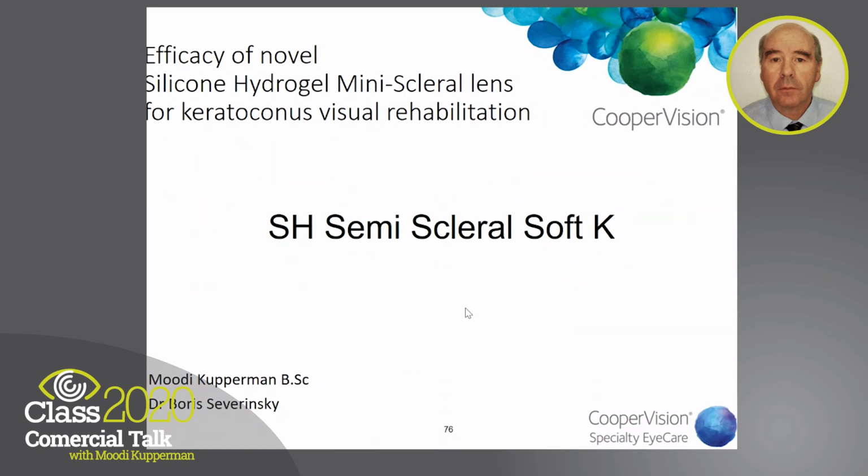When you use a stiff and big therapeutic lens, such as the semi-scleral soft K, the healing is very, very good without any pain, and the results were fantastic. And you can use these lenses later as a vision aid.